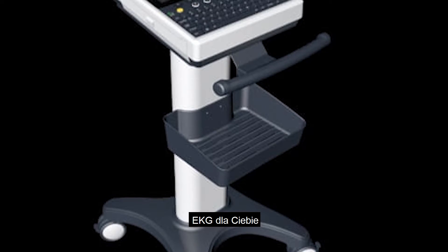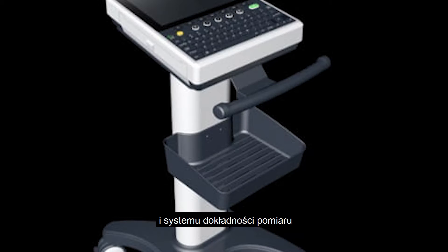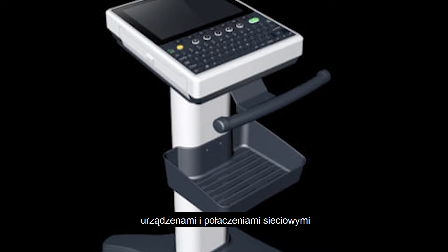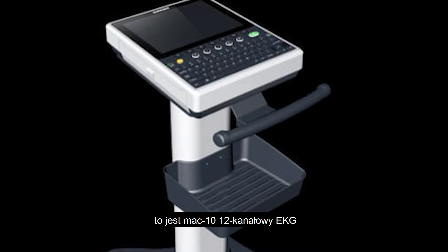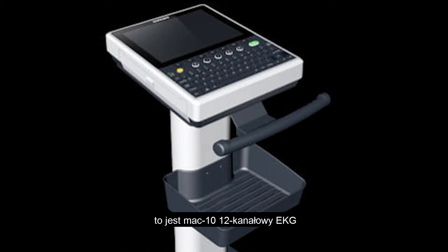Hello everyone, today I will introduce ZonCare iMac series ECG machine for you. After 10 years of development, ZonCare iMac series ECG machine has reached a world-class level in reliability and stability, data measurement accuracy, system response rapidity, connectivity between external equipment and network, unparalleled man-machine interaction and aesthetic design.